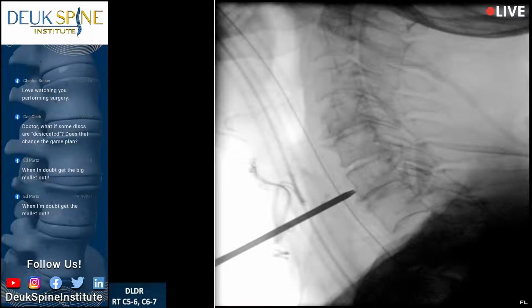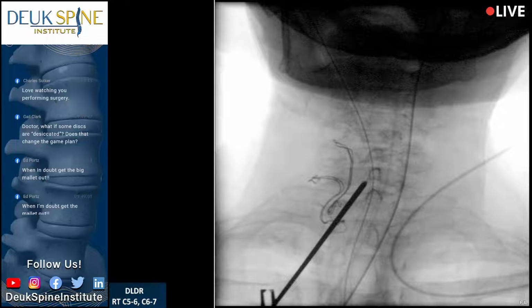Go ahead and give me an AP. Yeah. A little bit is fine. Right now as I navigate, it's not as important. It's a quick AP. All right, I'm a little to my side. Thank you. Back to a lateral.